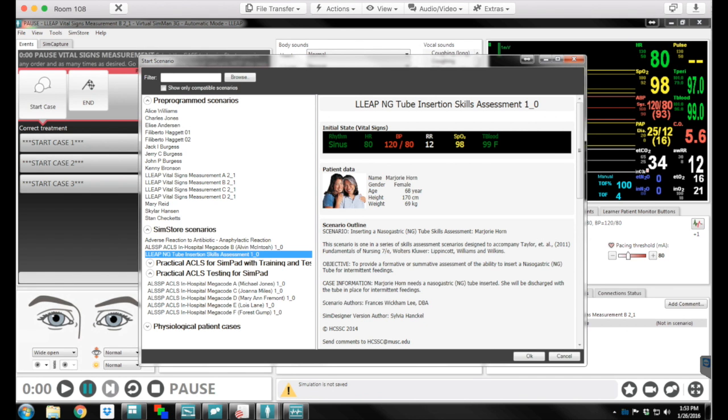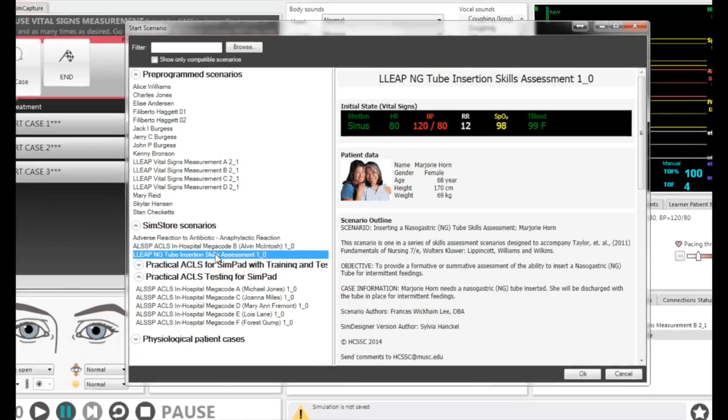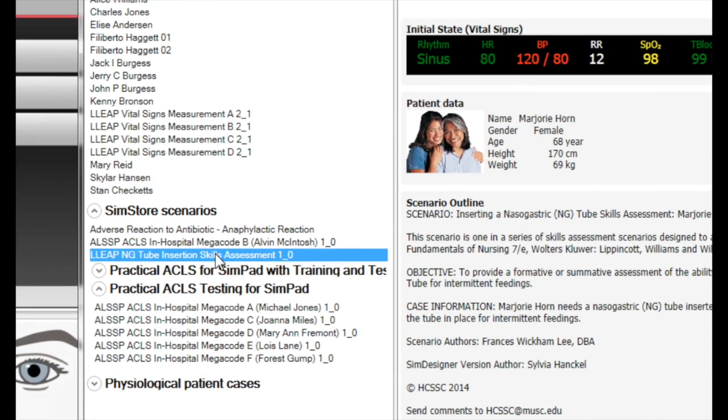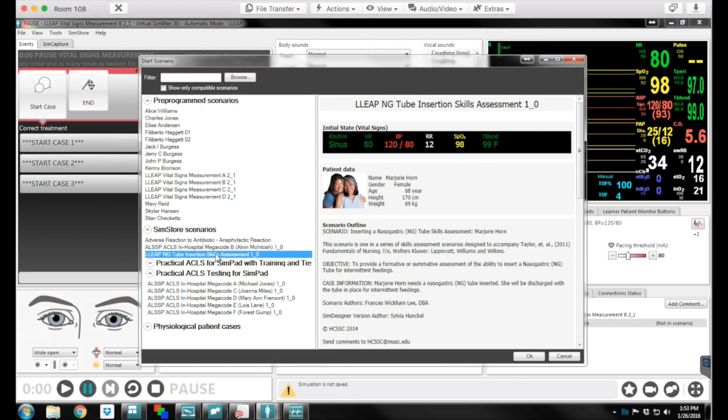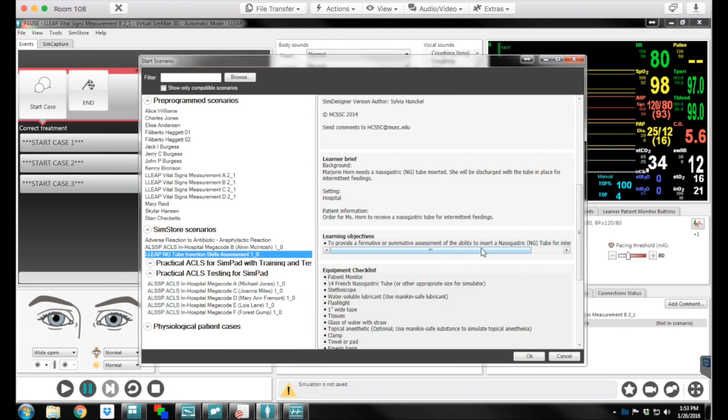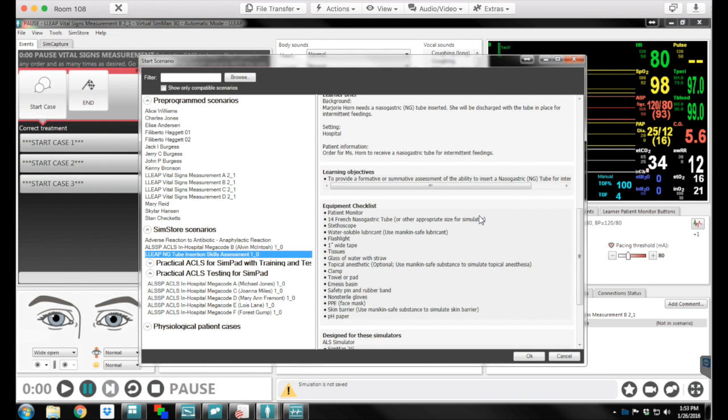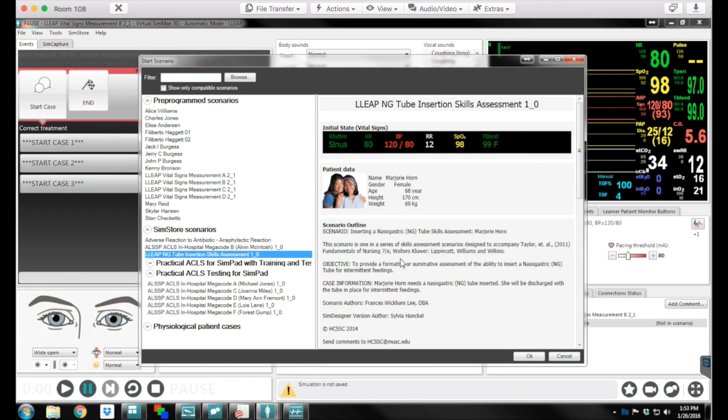So you can see I have it highlighted right here, the NG-tube insertion skills assessment one for LEAP, and then on this side it just gives you a little bit of the background and the scenario outline of what you're going to be working with today. So I'm going to load it up and click OK.